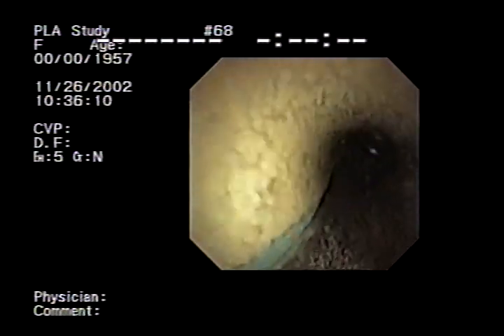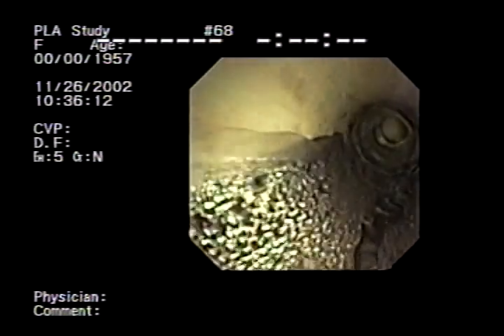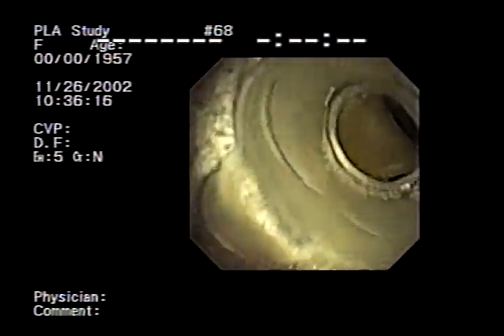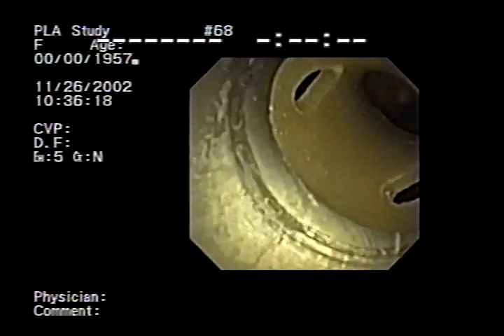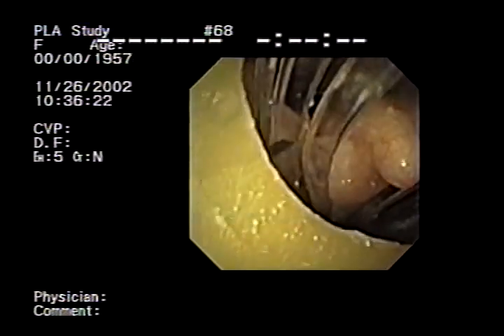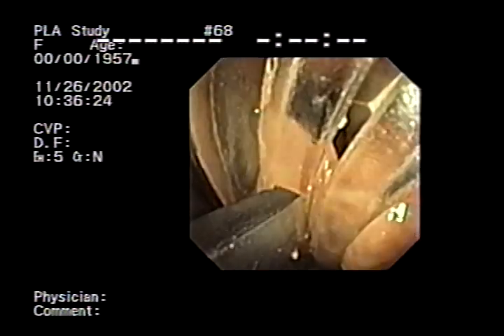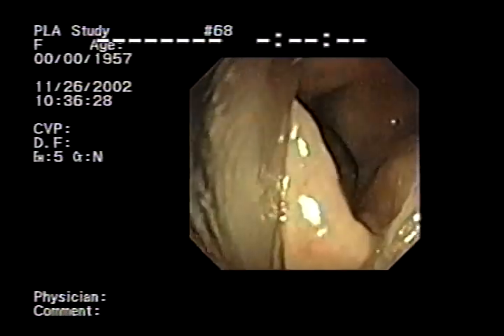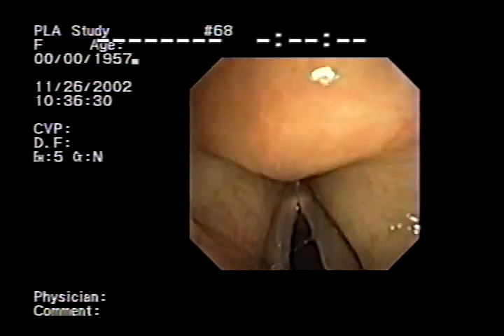After passing through the tube, the scope enters into the Cobra PLA head. From there, the grill is apparent, and the scope can be passed right through the grill and will usually be opposite the vocal cords.